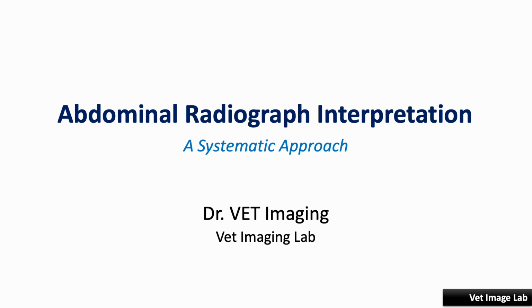Before we start, let me ask you something. Have you ever looked at an abdominal radiograph and thought, where do I even begin? Or, what if I miss something important? Well, don't worry. By the end of this lecture, you'll have a structured, reliable method to interpret abdominal radiographs with confidence. Let's dive right in.